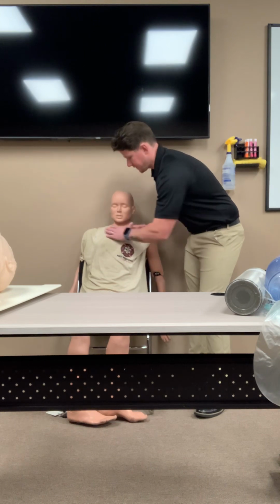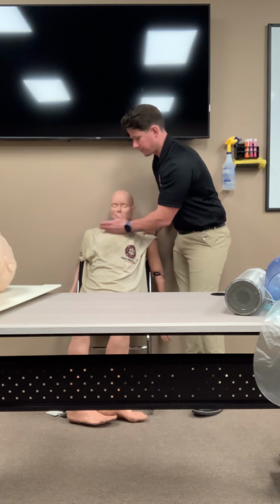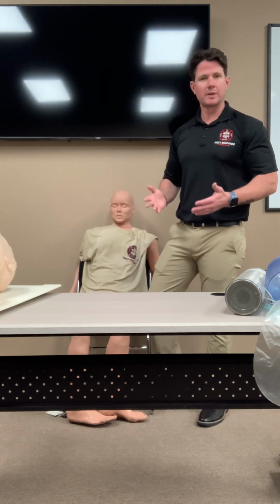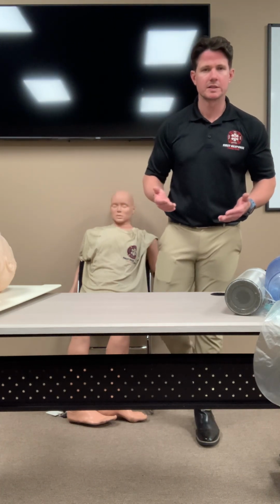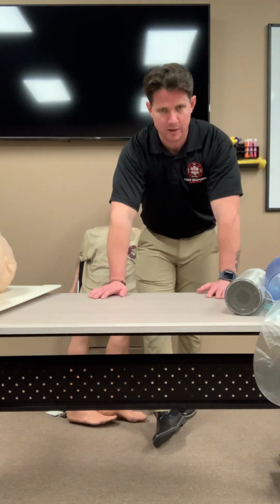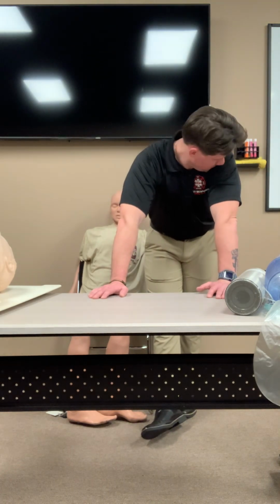All right, do I see anything on here I need to seal or stabilize? No. All right, I'm going to put this patient on 2 liters of nasal cannula oxygen based on his complaint. All right, you never go wrong with putting the patient on oxygen. We know in real life that that's not realistic, right? Sometimes it's better to not, but you want to make sure that we verbalize it, all right? Because we always need to consider oxygen for these patients, all right?